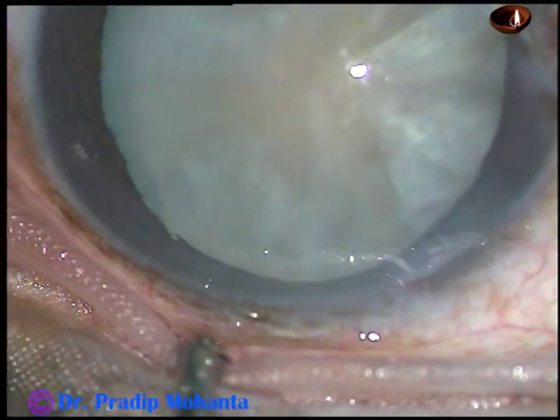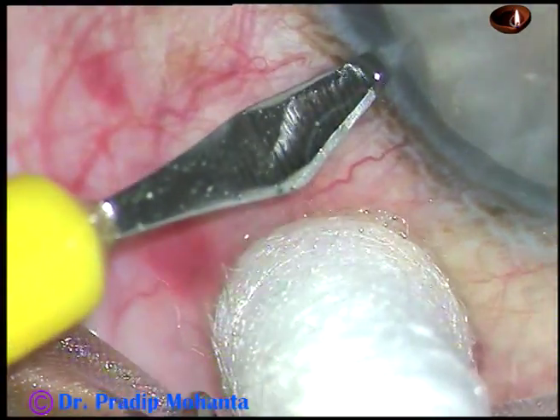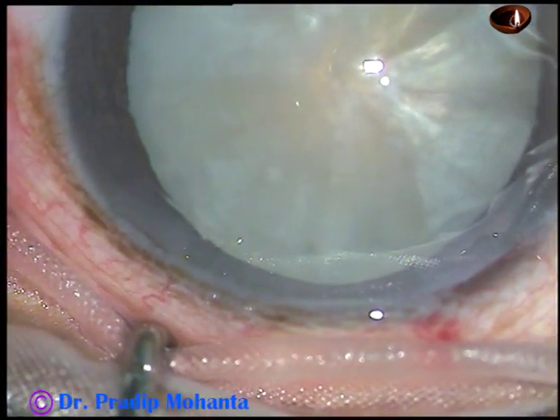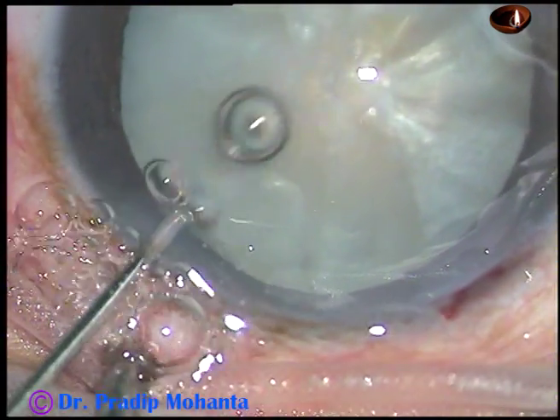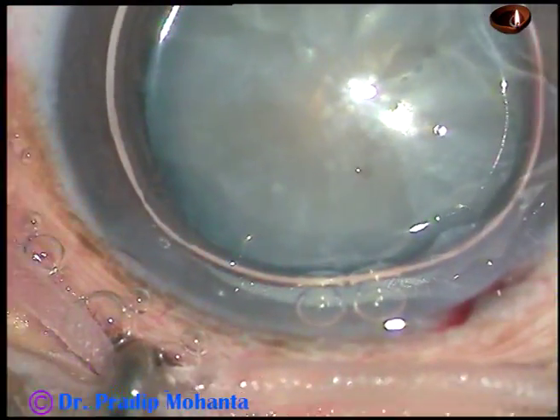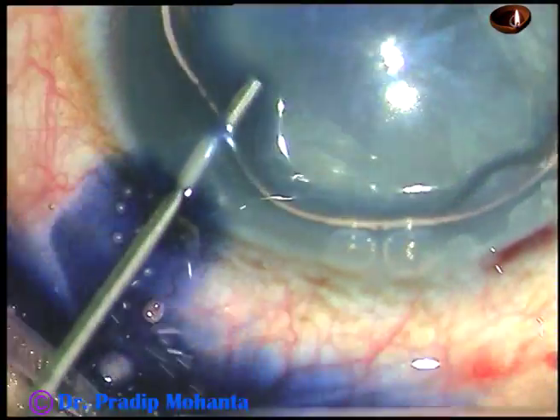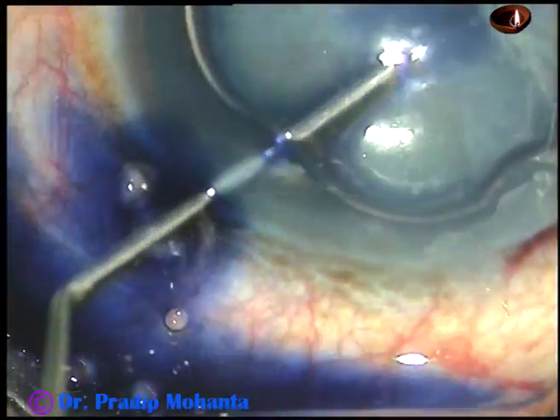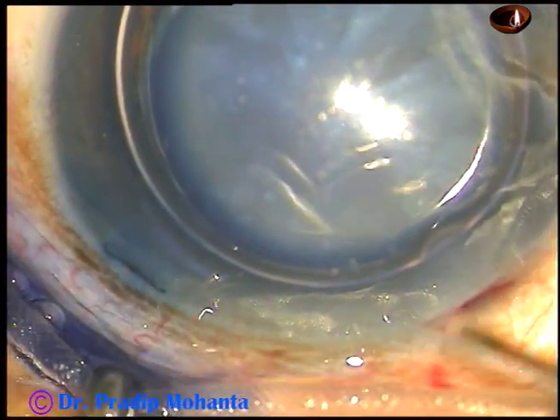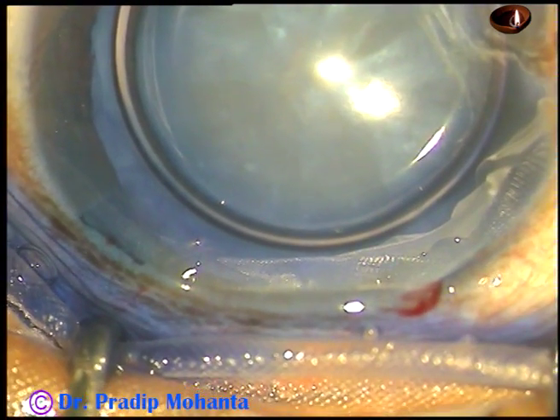By this time, the main incision has been made. And now, this is a side port on the left side of the main incision. And now I am injecting an air bubble into the anterior chamber, and I inject Trypan Blue dye underneath this air bubble. The dye should touch every point of the anterior capsule for uniform staining.